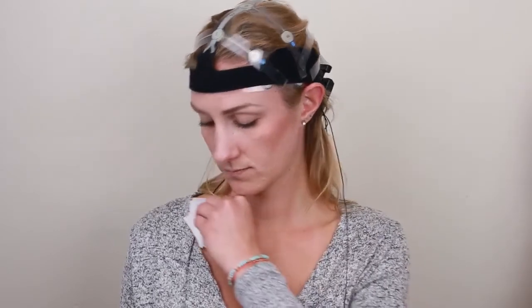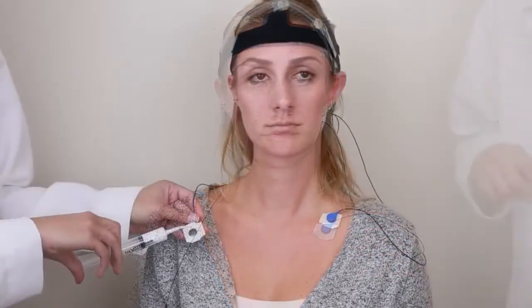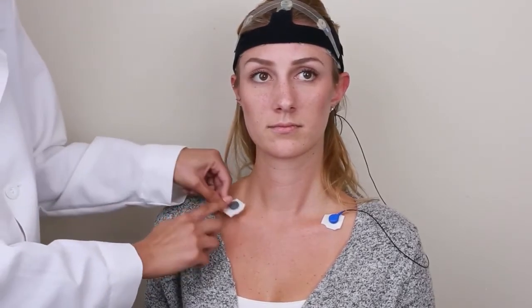If you are using the ECG leads, ask the participant to wipe their clavicle or collarbone on their left and right side with an alcohol swab. Attach electrodes to the end of the ECG lead cables. Beginning with the lead connector colored blue, peel off the backing of the electrode to expose the adhesive side. Fill the center with a dab of Synapse Cream and adhere it to the participant's left clavicle bone. Follow these steps for the gray lead cable connector, adhering to the right clavicle bone. A good way to remember the side-dependent ECG connector placement is with a mnemonic device: blue goes to the left side — both blue and left have the letter L for left side. Likewise, both gray and right have the letter R for the right side.